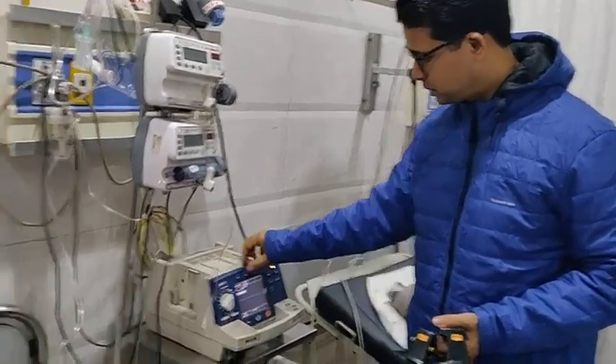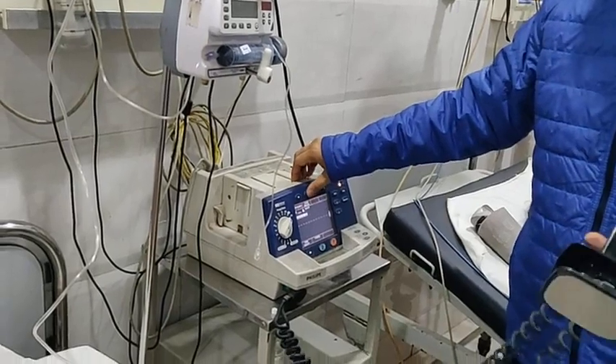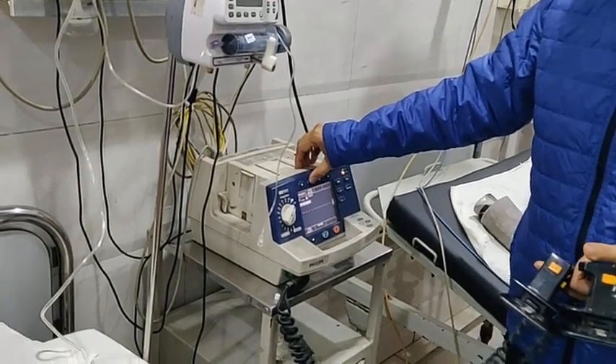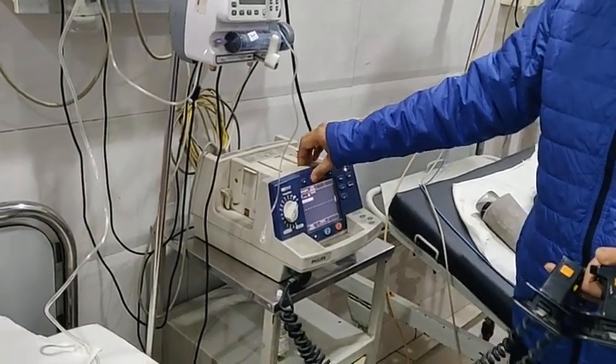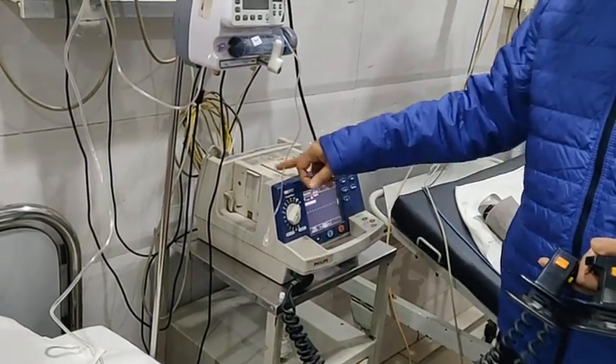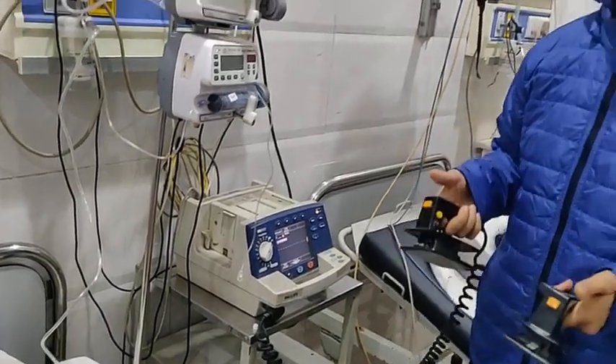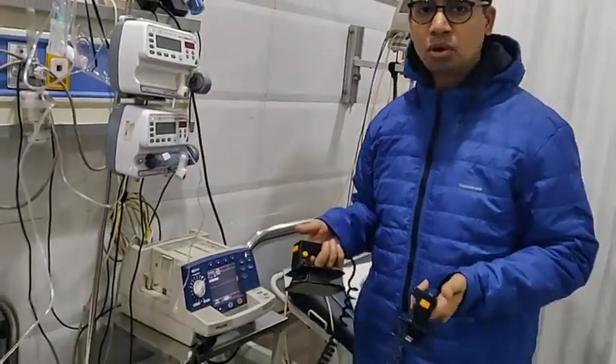We will place this lead to lead 3, and thus comes the paddles. Once it is on the paddle setting, it will deliver its ECG showing how the rhythm is getting converted — with VPCs, with pause, and whatever changes occur.